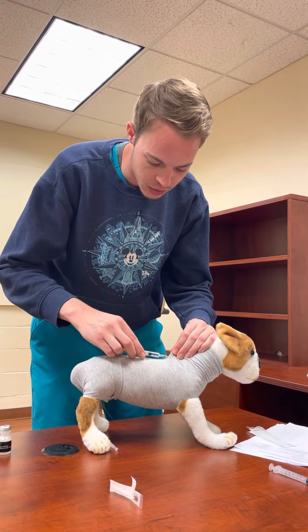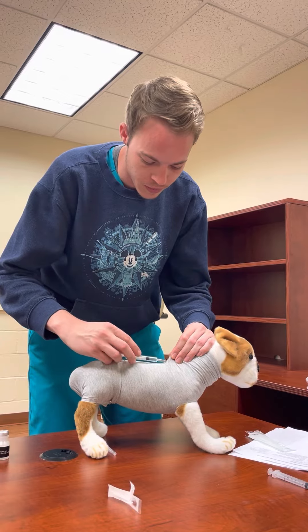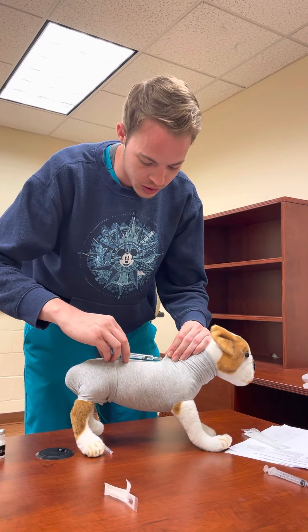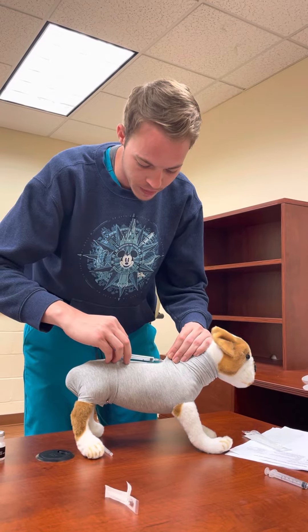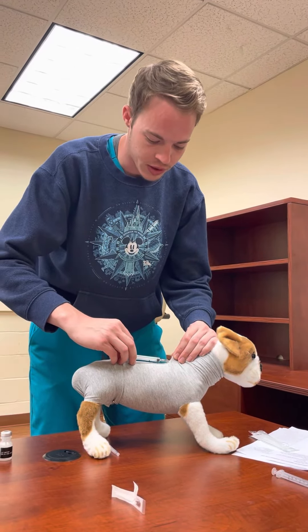Before we inject, we need to pull back to make sure we don't get any blood or air, in which case we would need to reposition the needle. If that's all good, we're going to give the injection at a moderate rate. If there's any type of resistance, that means we might be intradermal and we need to reposition as well.